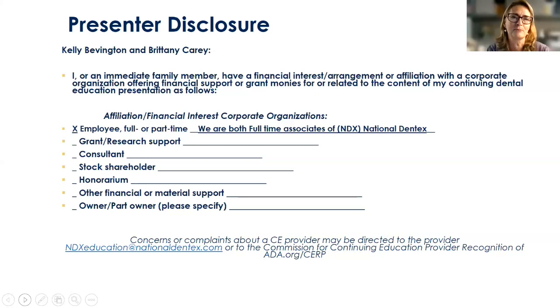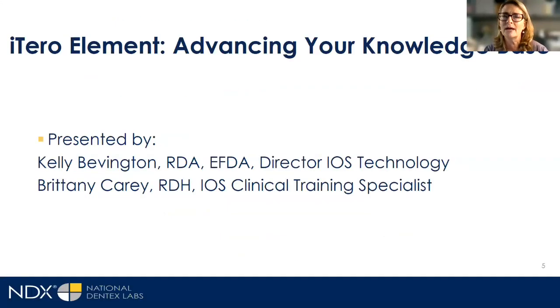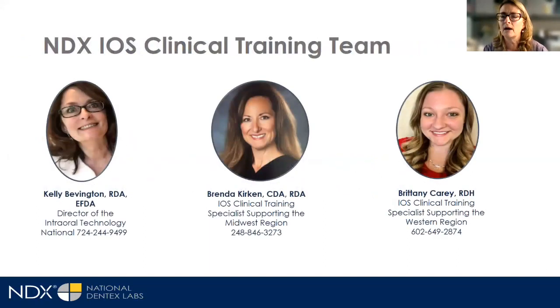Thanks so much, Jessica. Appreciate that. Full disclosure, I am an employee of National Dentex. So, iTero Element, advancing your knowledge base. We are a team of intraoral scanner trainers here at NDX. Myself, I'm an RDA EFDA. I manage the team, but I cover the East Coast as well. Brenda Kirkin is a CDA RDA, and she covers the Midwest. And Brittany Carey is an RDH, and she covers the West.